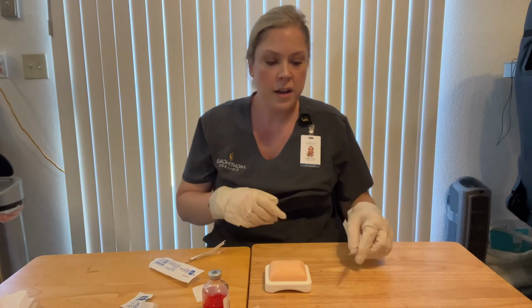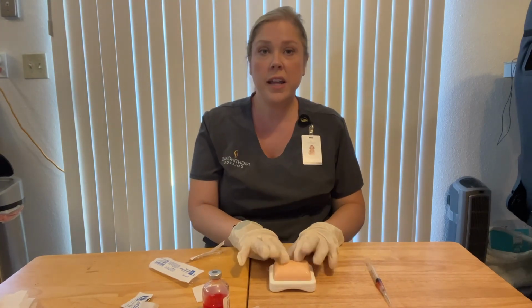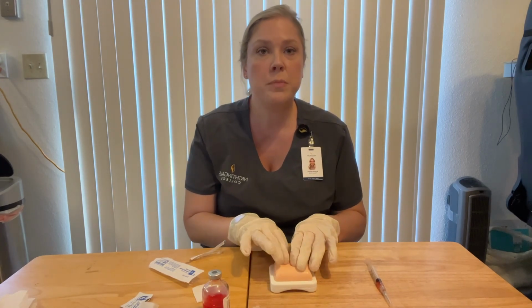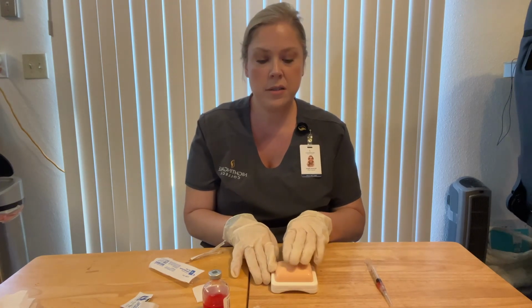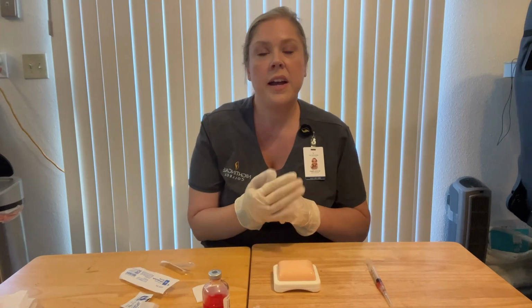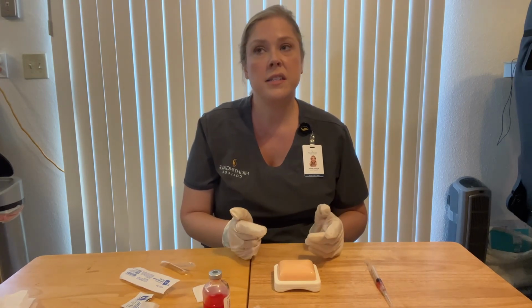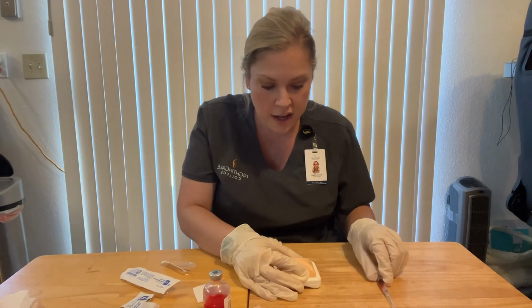I'd want to inspect the skin surface for bruising or inflammation or any edema. And if there was, I'd want to select a different site. I would then want to palpate the site and avoid the area with any masses or any tenderness. And then I'd want to test the needle size with the skin to verify that the needle is 1/2 of the fold. So we just test that.